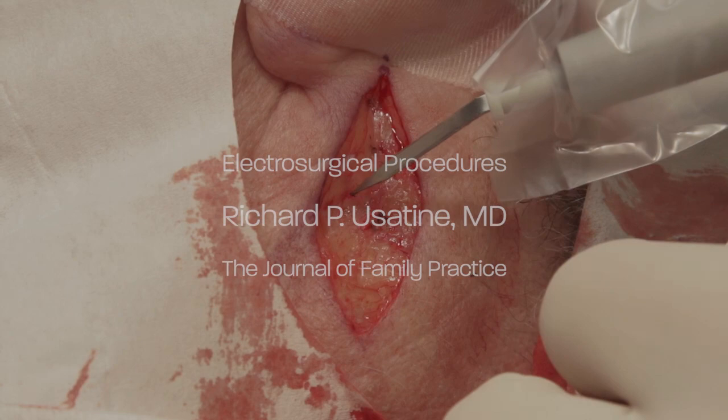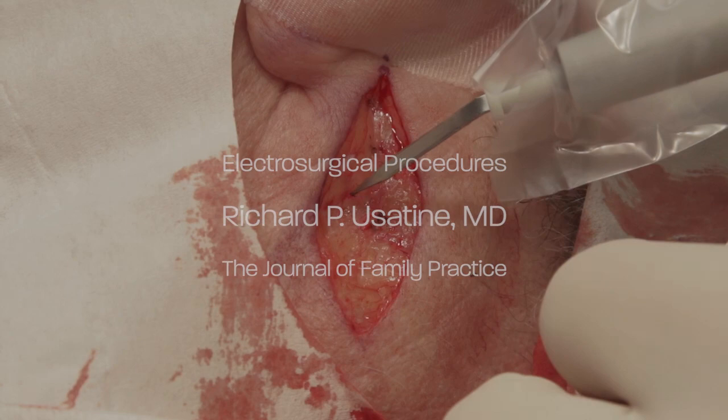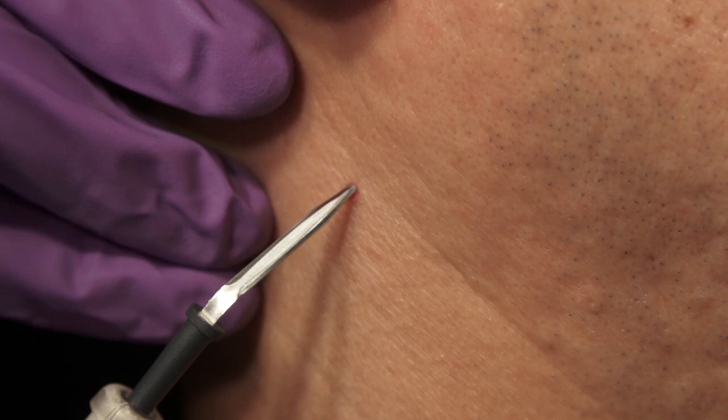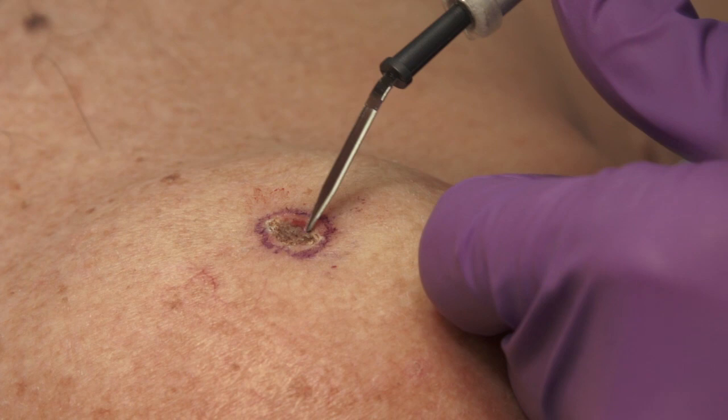Today we will demonstrate electrosurgical procedures. Electrosurgery is an important modality for dermatologic procedures. It can be used without anesthesia for small cosmetic procedures or with anesthesia to stop the bleeding during skin surgery. It can also be used to destroy skin cancers with electrodessiccation and curettage. We will demonstrate all of these procedures.